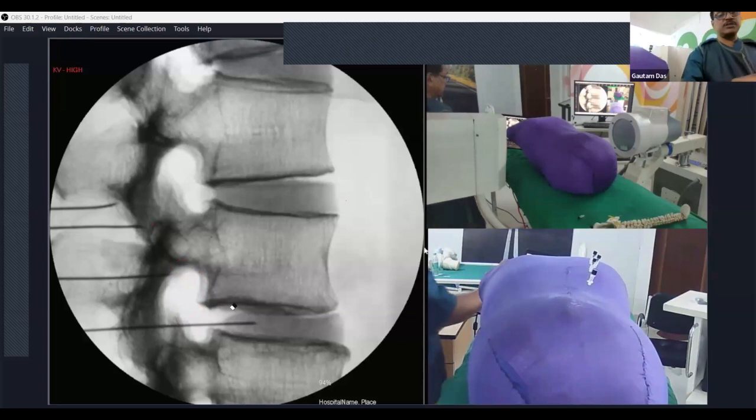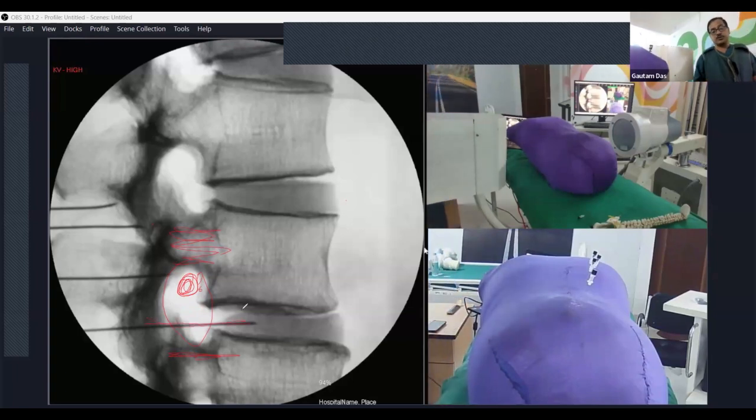So you see, this is the whole of this neural foramen bounded by one pedicle above. This is one pedicle. This is another pedicle. So your upper part is occupied by the nerve root. Here is the nerve root and radicular blood vessels. Lower part, you have to come to the lower part. This is known as the transforaminal approach, transforaminal discography approach.